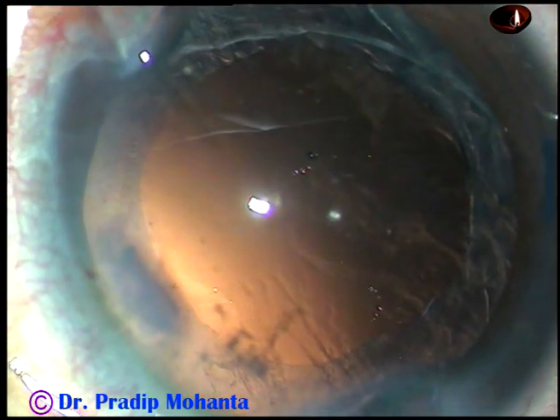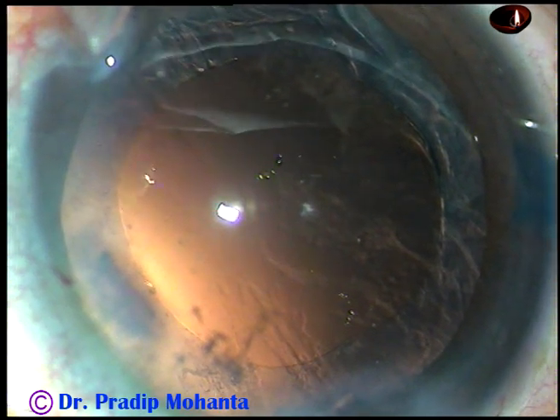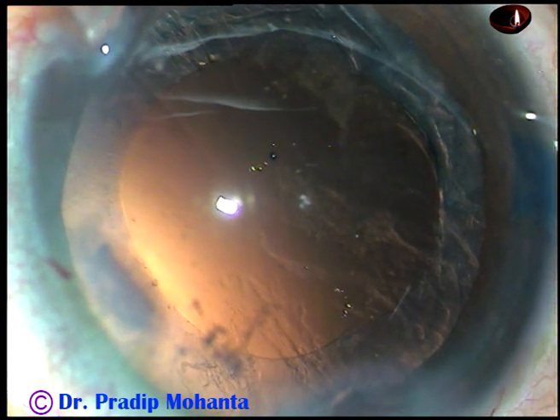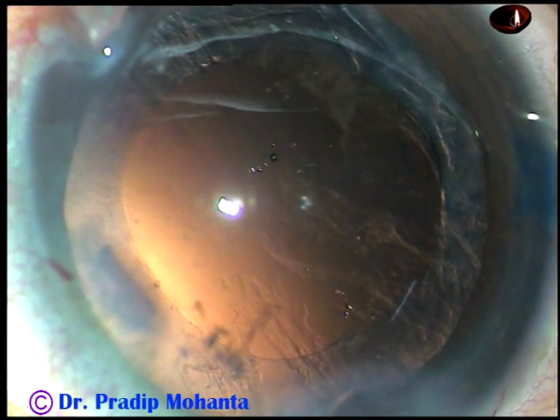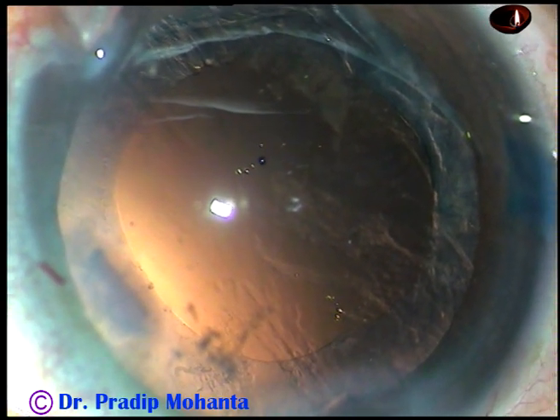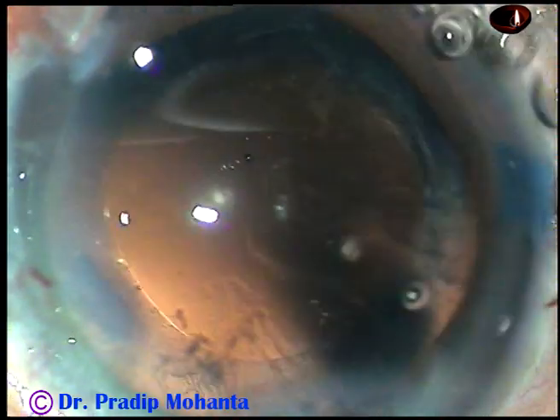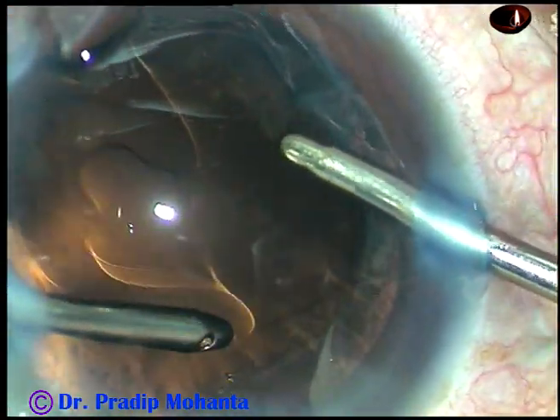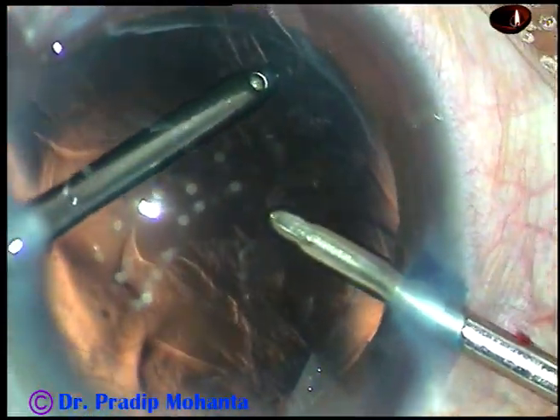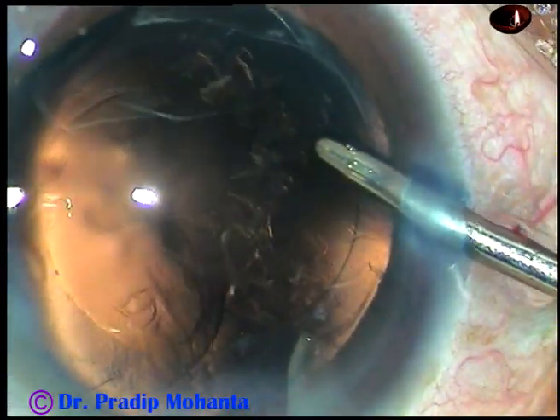Now, cortical cleanup. I use a Simcoe cannula in most cases. Many of my colleagues ask me why. Because I don't see any difference between a Simcoe cannula and a coaxial I/A. I use the Simcoe as a coaxial I/A, so Simcoe is fine. I can manage with only one-site port. But bi-manual looks elegant, so let us use bi-manual irrigation-aspiration.